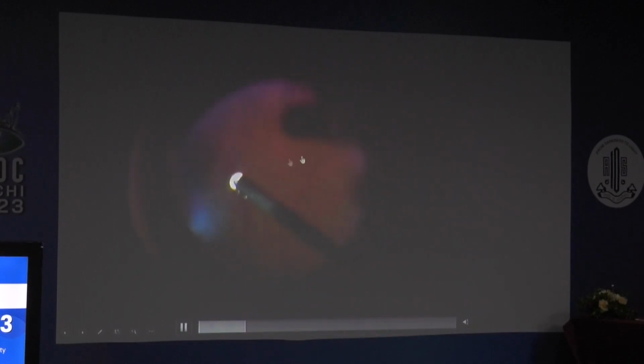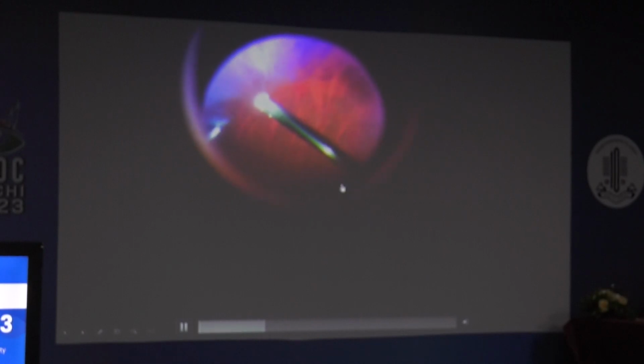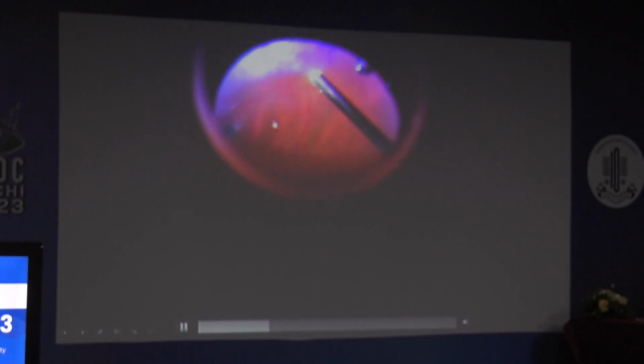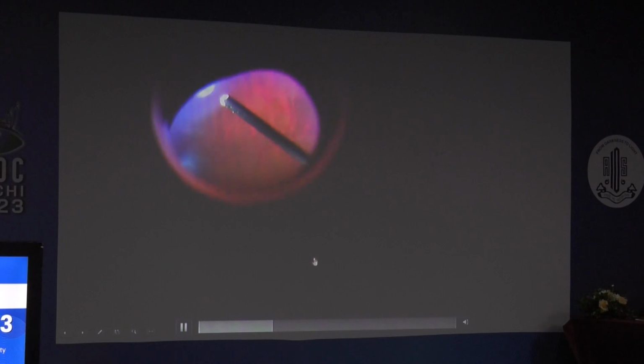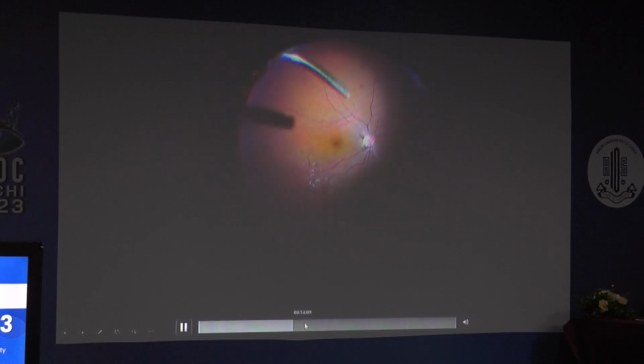If there's small ooze, I think you can in the meanwhile do peripheral vitrectomy, go all 360 degrees, and don't try to take out the probe too often. And you can take out with the help of suction this loose blood which may happen during surgery. This can be taken out with the help of cutter alone.